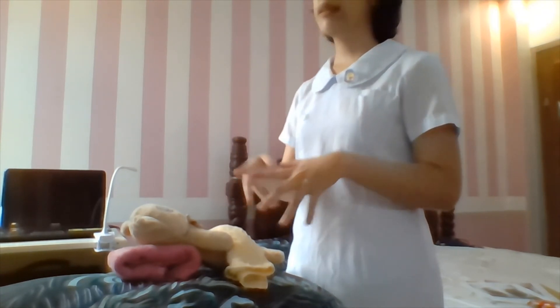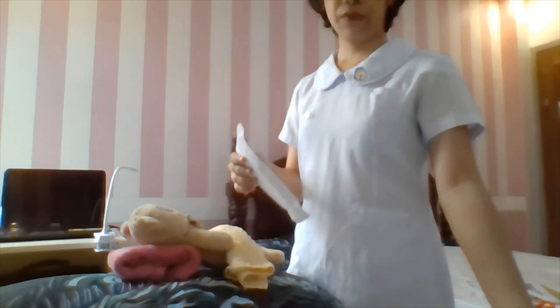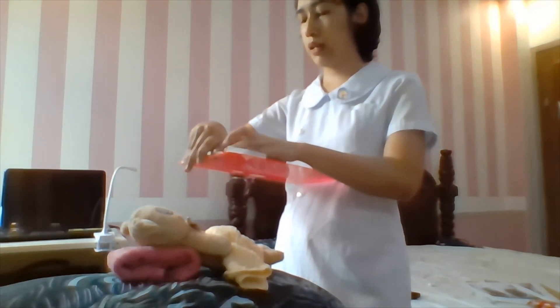Sanitize before and after the procedure, as well as any used equipment. Evaluate the gathered data for the quality of the ECG obtained. Attach the ECG strip onto the patient's medical chart, and note the patient's name, date, and ECG strip obtained.